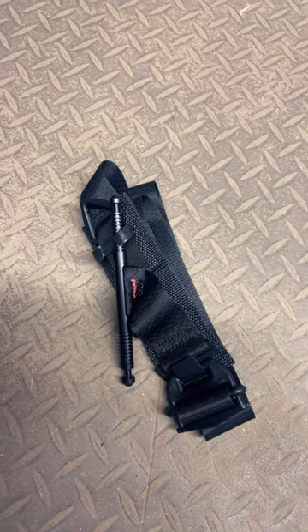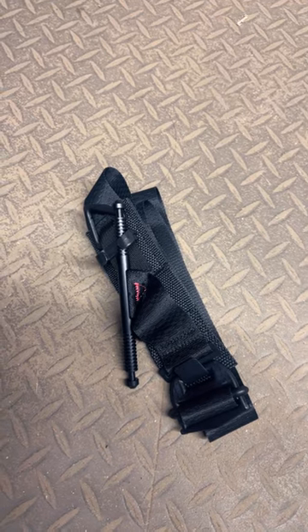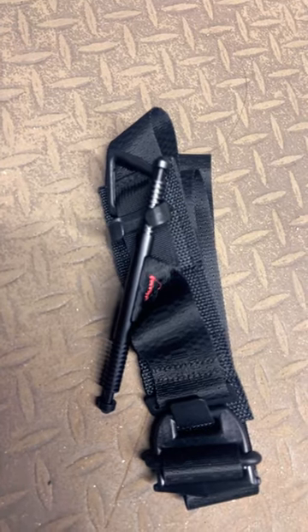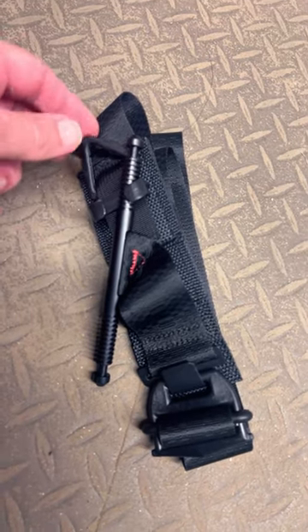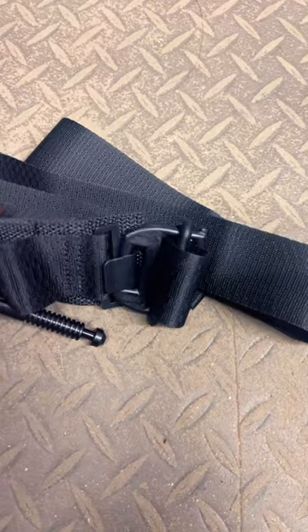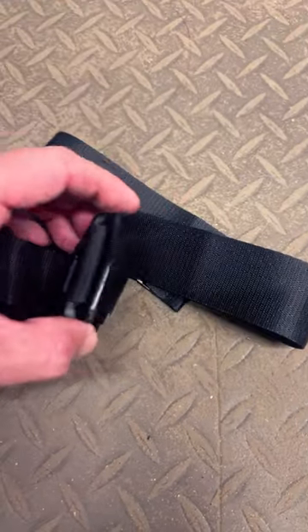We're going to take a quick look at the latest generation soft tourniquet from TapMed Solutions. There is a nice upgrade on the windlass — you have an assistance clip right here that still locks into the triangle. The buckle is a huge upgrade on this generation soft tourniquet, and the webbing flows nice and free.